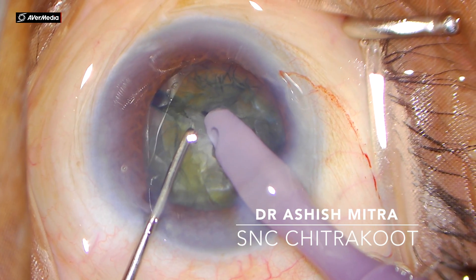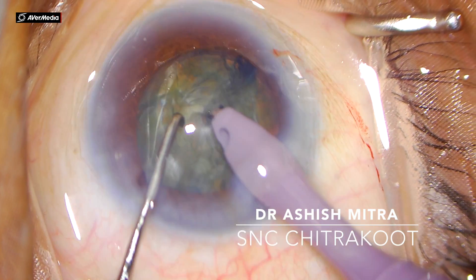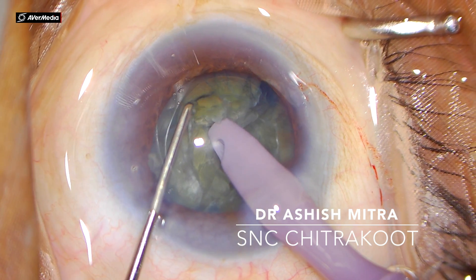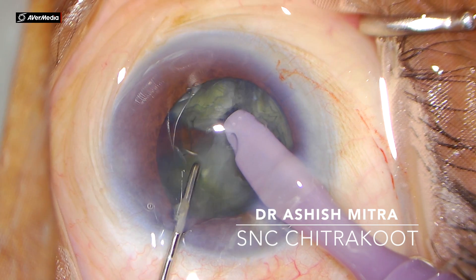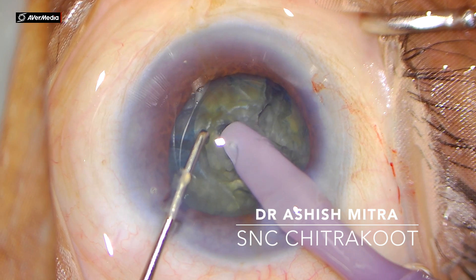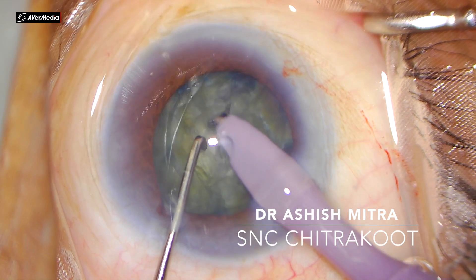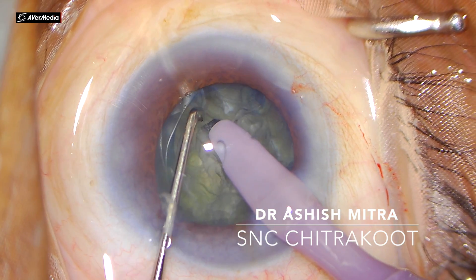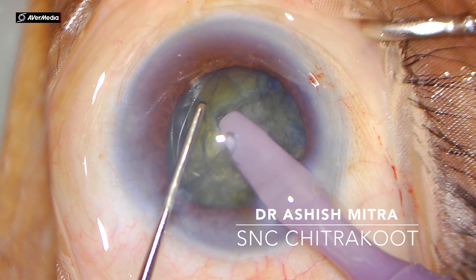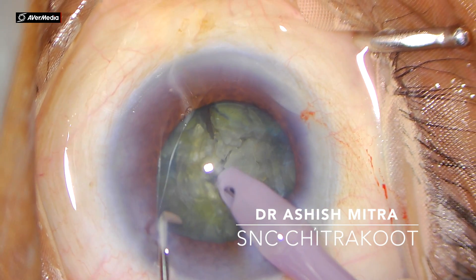I lost my hold — I went to foot position 3 and came back to 2, but the hold was there and I was able to crack. Make the first chop. Similarly, bury again with the chopper in front of the phaco probe and crack. You need to create small 6 to 8 pieces like this. In cases of soft cataract it is very easy to emulsify as you require less power.